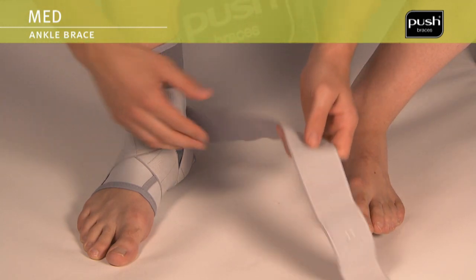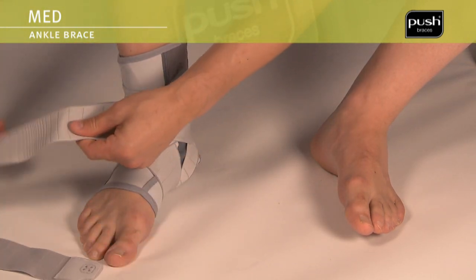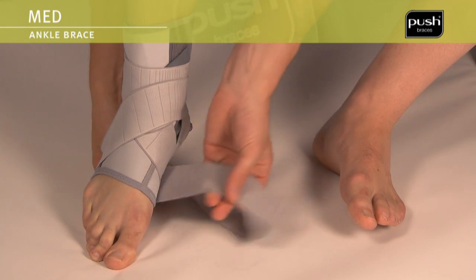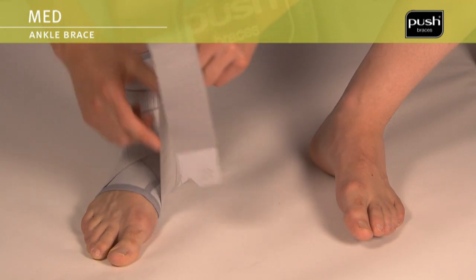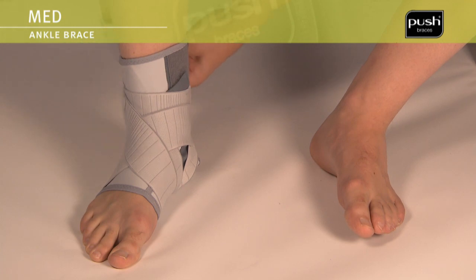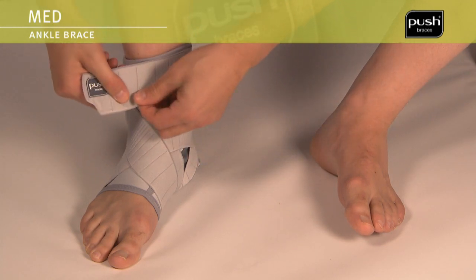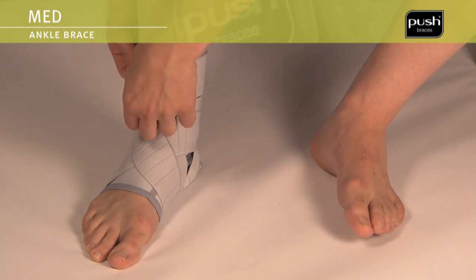Tension the heel lock on the second band. Position the band diagonally across the instep in the direction of the outer foot. Then pull the band underneath the foot towards the inside and diagonally across the instep to the outside of the lower leg. Close the elastic band with a single wrap around the lower leg.